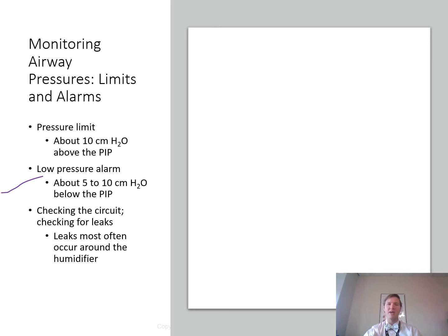If a leak in the patient ventilator circuit is not obvious, then you should go ahead and manually ventilate the patient with a bag until you can identify the cause of the leak. So when in doubt, use that backup ventilator, the self-inflating or flow-inflating bag, depending on what type of patient you have there.